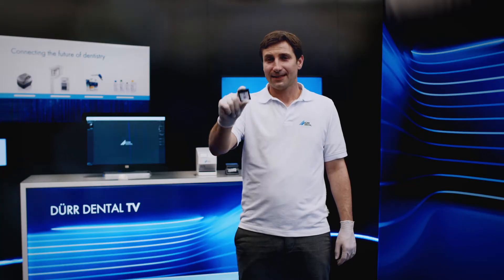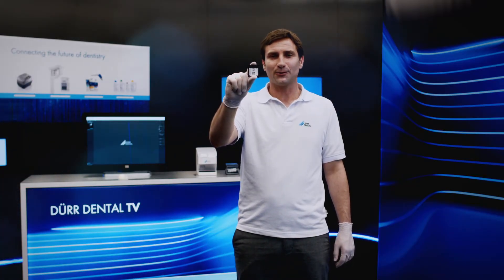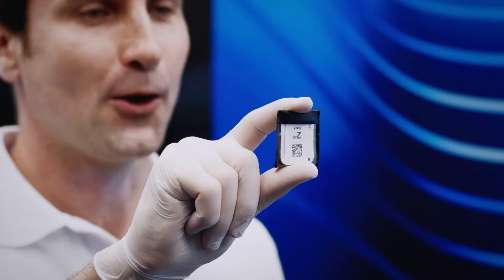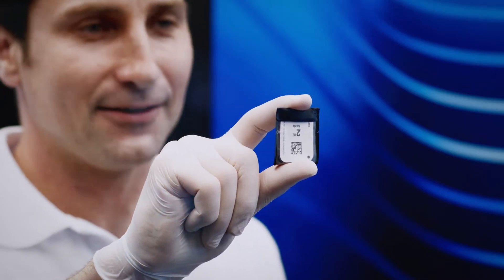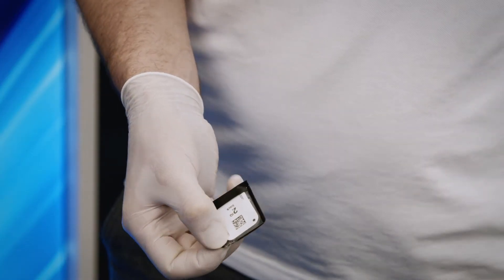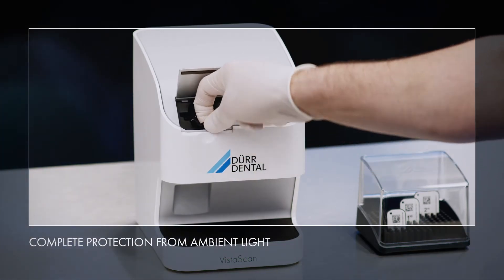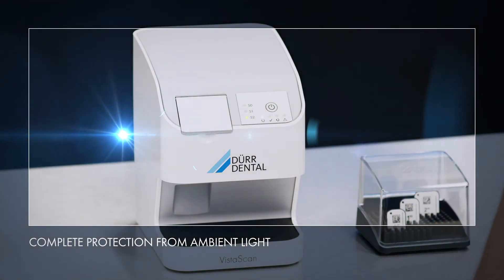Original DoorDental light protection covers effectively prevent ambient light from erasing image information from image plates throughout the entire workflow, while providing reliable protection against cross-contamination at the same time. The light protection cover is very easy to open. The feed-in concept of VistaScan NanoEasy ensures that the image plate is always fully protected against ambient light.